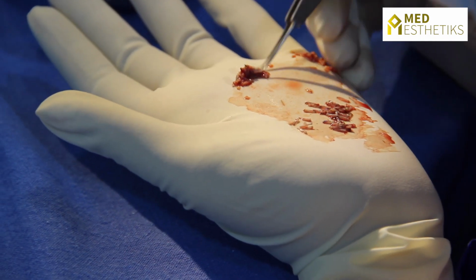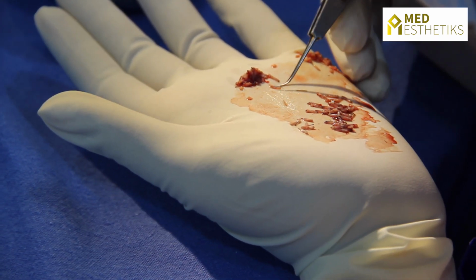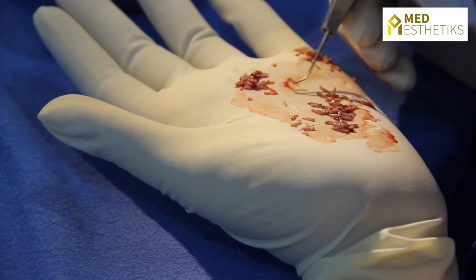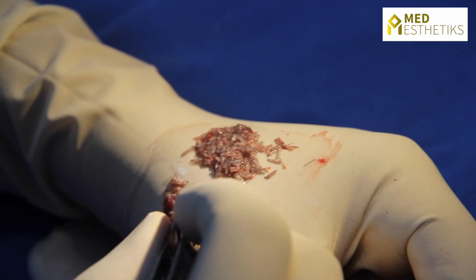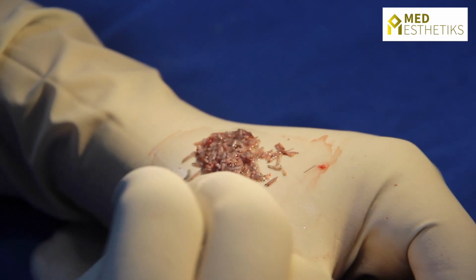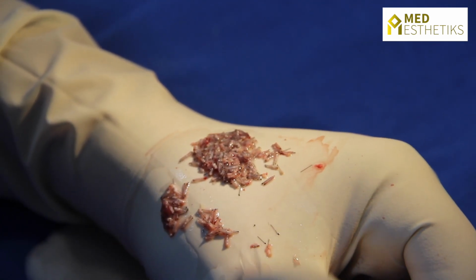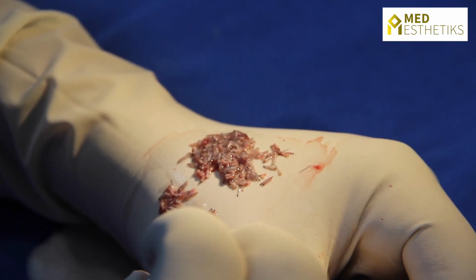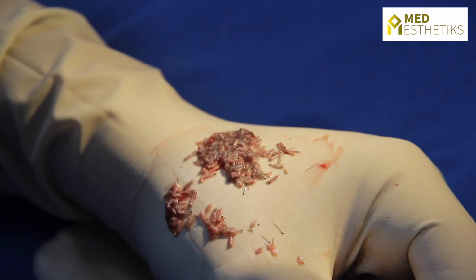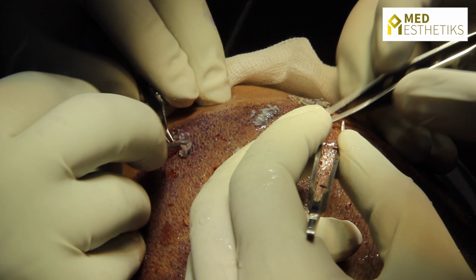Since we have made around 3500 slits, the target number of the grafts is 3500, and here we are separating the grafts. The grafts are either 1 hair, 2 hair, 3 hair or 4 hairs. These grafts are separated according to the number of hairs in them. And now we are seeing the placement of the grafts.